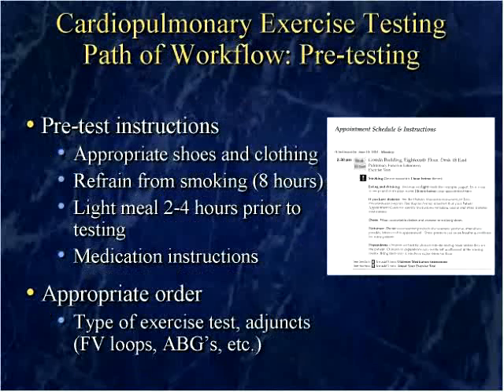Also in the pre-testing environment, we need to make sure that the patient is given pre-test instructions. And I have an example of our itinerary or our pre-test instructions that are given to the patient when they arrive in our laboratory here. And essentially it spells out for them what are their expectations before they arrive. When I talk to people about this, or even the pre-test instructions for a pulmonary function test or any type of diagnostic test, I often use the analogy of having a fasting glucose. If a patient doesn't get those pre-test instructions not to eat prior to midnight and they have a Snickers bar at 2 in the morning, well, that certainly is going to affect their lab results in the morning when they have that blood draw. Well, that's the same thing with our patients. We need to make sure that they're prepped for the test.